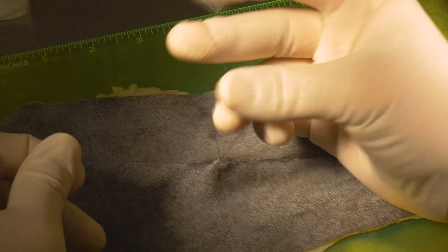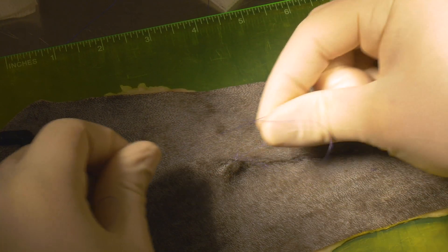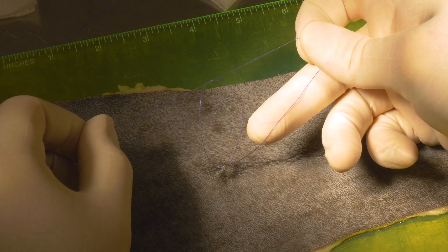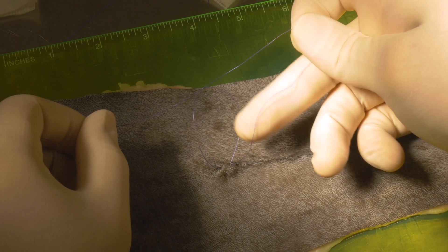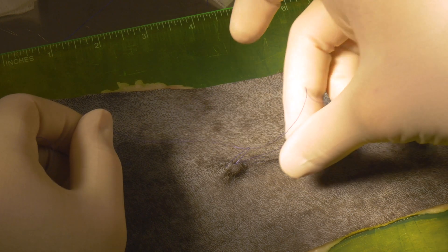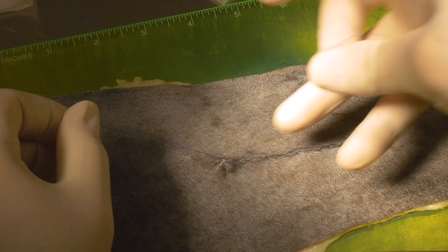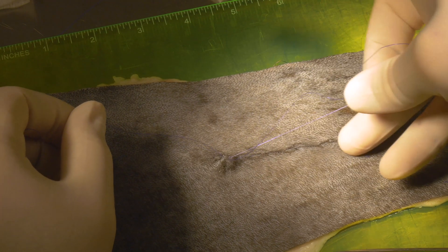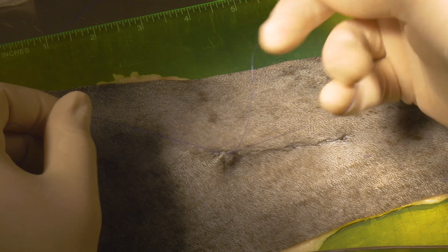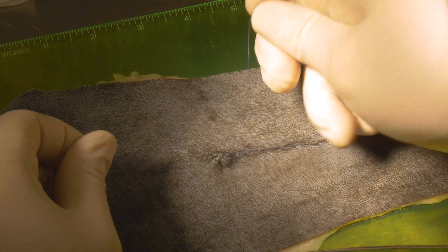So that will tighten it up. You'll take two fingers, grab the suture from the other side, still hold it with your non-dominant hand, and pull through. Now this top one is the floss strand — this is the one attached to the rest of the suture line, and when I pull on this one, this loop will go down. So I'm leaving this top floss strand nice and loose, just to where it goes down to the skin. You don't want to pull too hard, because it will accordion your incision since it's a continuous pattern and there's not much friction on monofilament suture. Now do it again, pulling the bottom one.